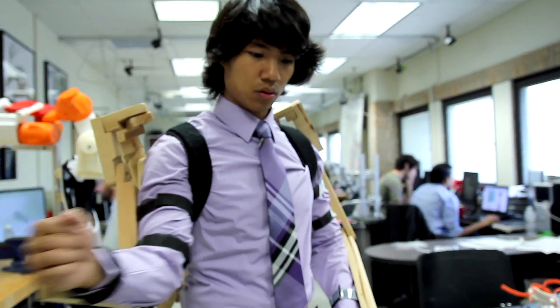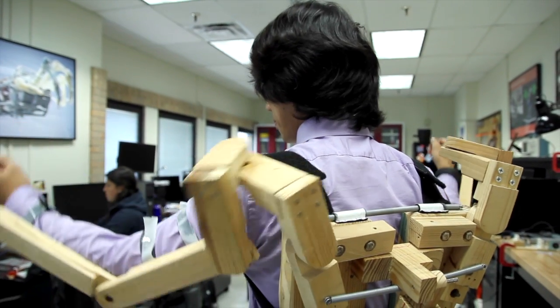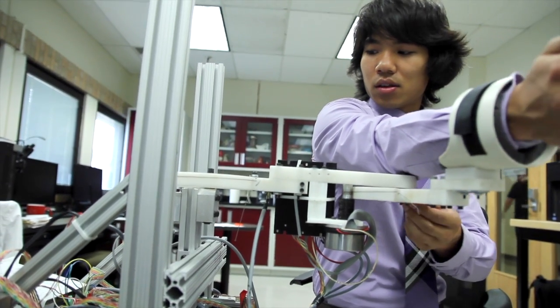When a stroke occurs, patients must undergo therapy within the first month for a chance to actually regain their lost functionality. In traditional therapy, it's difficult to quantify the results of the patient. However, with the upper body exoskeleton, what makes it novel is that it allows patients to track their progress — they can see how well they're improving.